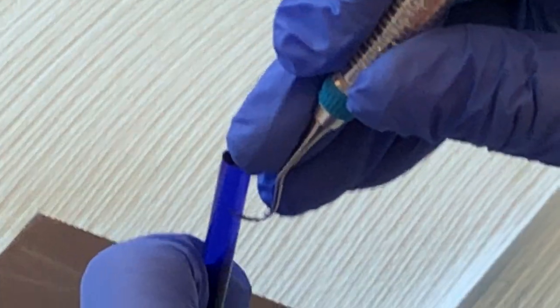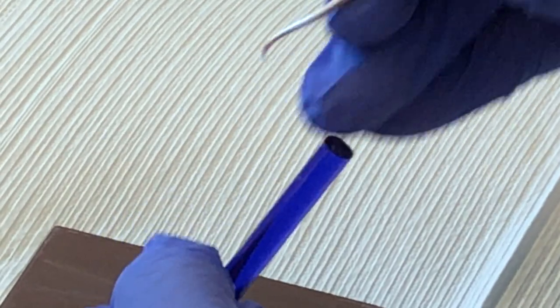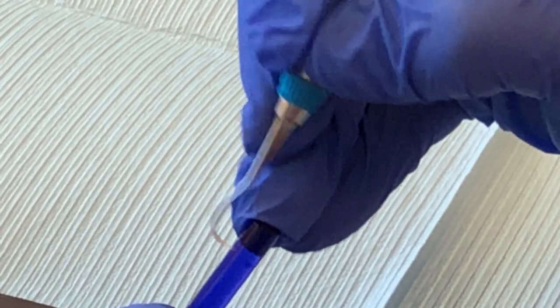And test for sharpness on both sides. Then it grabs the test stick.